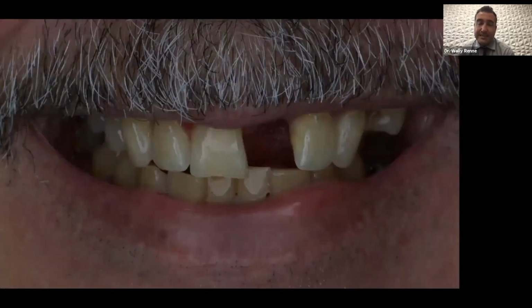Patient was happy, but when I look at it, if I had thrown that into Smile Design, I would have known immediately that there's a little bit of a size discrepancy between 8 and 9. And I probably would have added some resin to tooth number 9 to decrease the space before doing the restoration. So I have learned in the past to sometimes, when you're doing a single central, break out the Smile Design software.